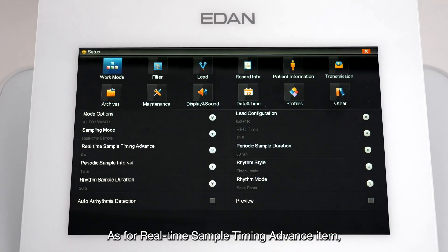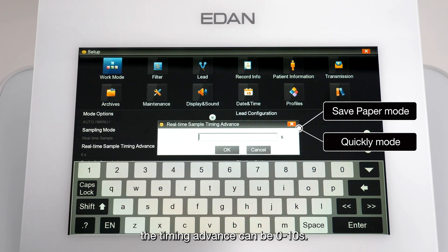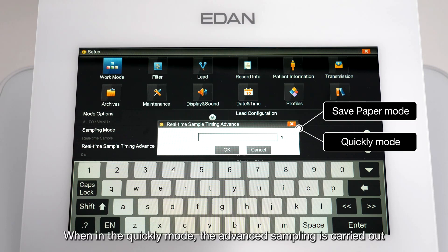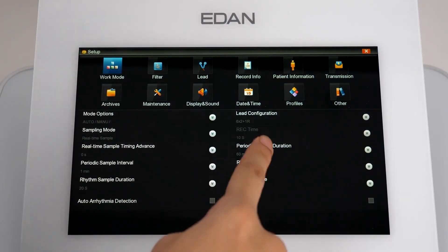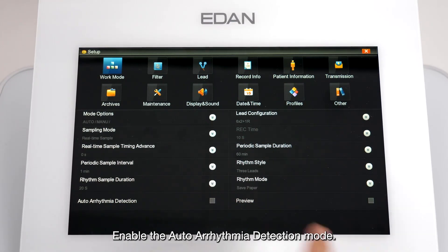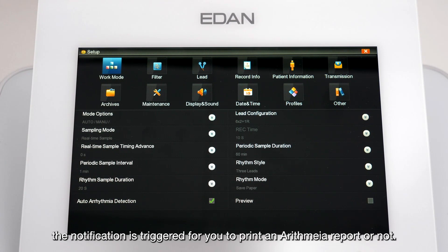For real-time sample timing advance: when in Save Paper mode, the timing advance can be 0 to 10 seconds. In Quickly mode, the advanced sampling is carried out 10 seconds earlier than when you press the start or stop key. You can also enable the auto-arrhythmia detection mode; when an arrhythmia diagnostic statement is detected in the auto-ECG report, a notification is triggered to prompt you to print an arrhythmia report.